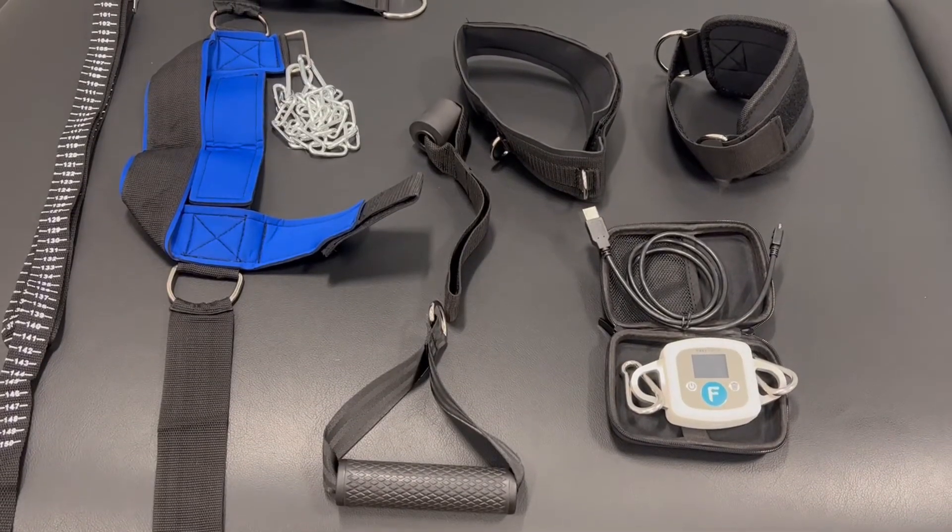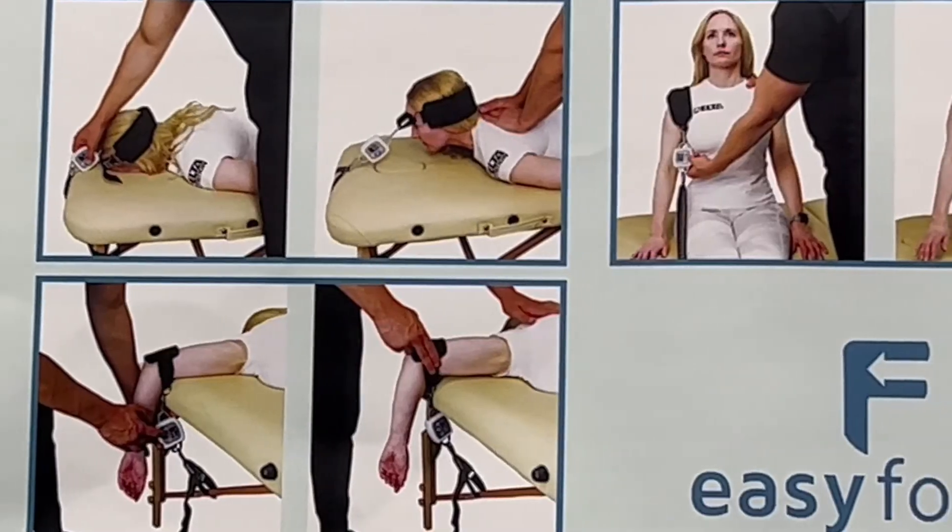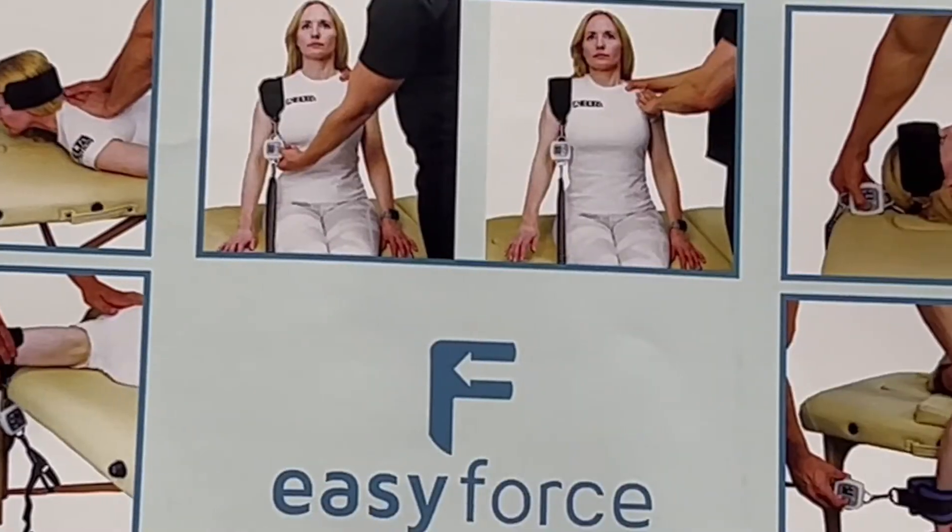There are a few different attachments you can add on for the Easy Force, such as different handles, ankle straps, thigh straps, and the neck strap. So you can assess how strong someone's knee extension is, their elbow flexion, or even their neck flexion, among many more. They have an entire poster of pictures showing how to measure and what can be measured.